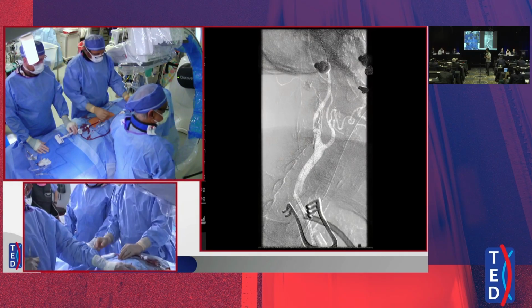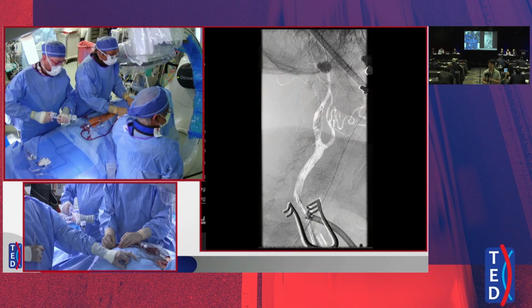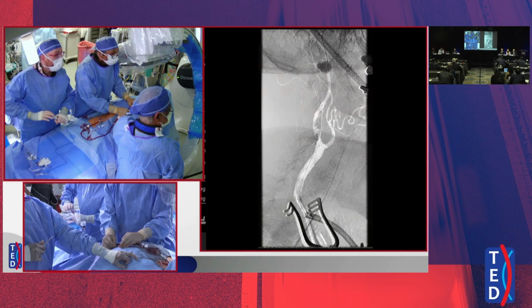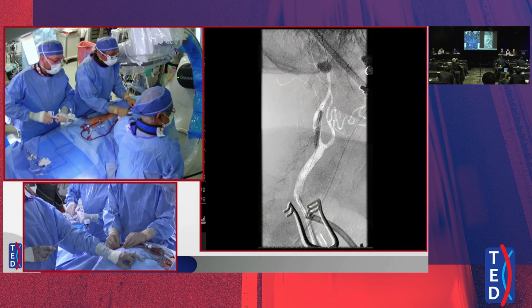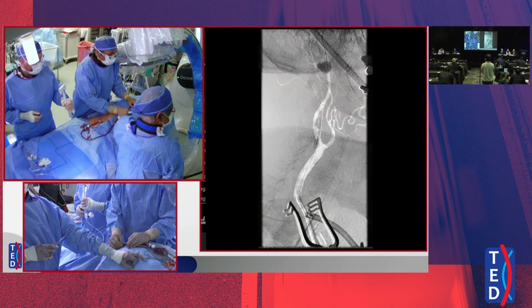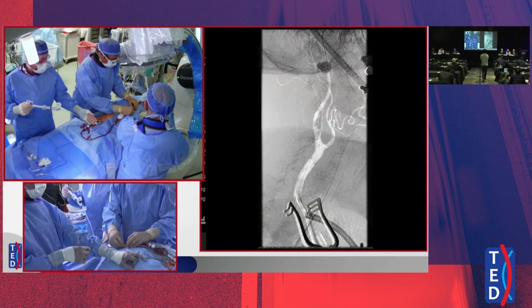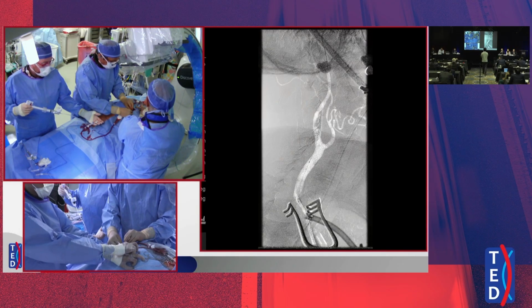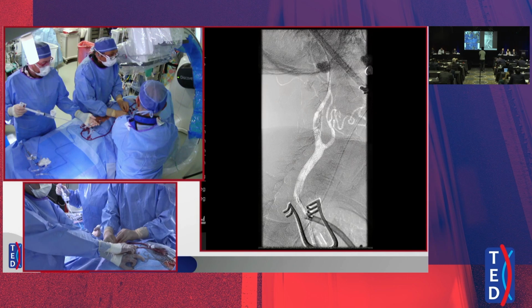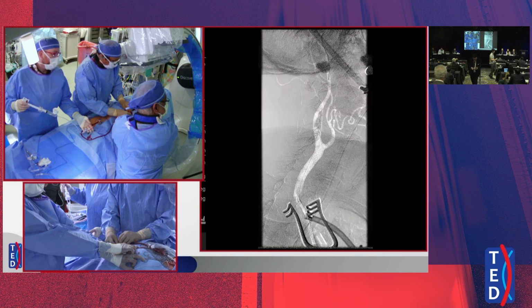Balloon up, please. Blood pressure is 152, heart rate is 77. We're taking the balloon up. Balloon up. Yep. Balloon down. Tolerated beautifully. Okay, take this balloon out. Hold this. Can you just keep it live? Watch that wire, please.